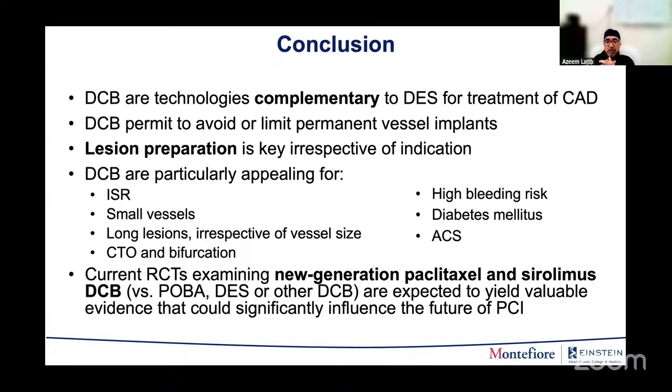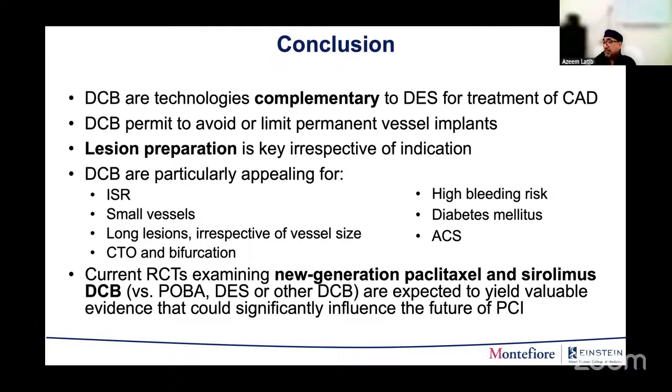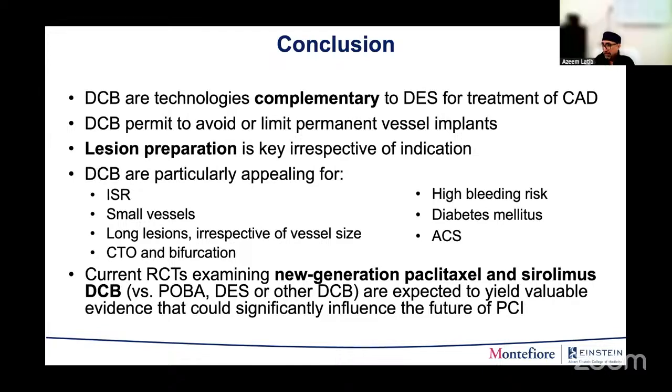And this is a challenge when doing de novo disease, and right now, honestly, I would encourage us, because the only way we learn about this is to generate data, to enroll de novo disease patients in a clinical study. We're lucky at Monty, we have so many clinical studies. We have 3 right now on drug-coated balloons, 2 of them in de novo, 2 in ISR. And we're going to have 1 or 2 more in the next couple of years. So let's collect the data and let's learn.